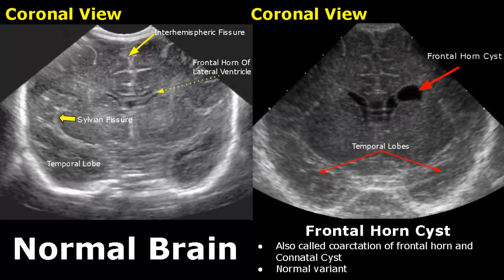A frontal horn cyst can be a normal variant. It is also called coarctation of the frontal horn and a conatal cyst. It is usually formed by folding of the frontal horn on itself.